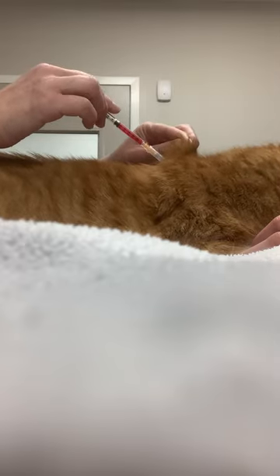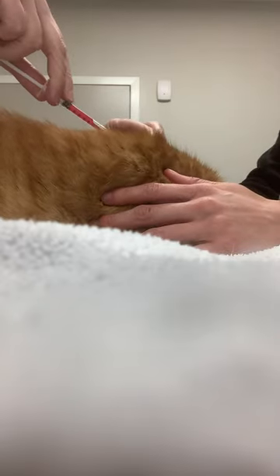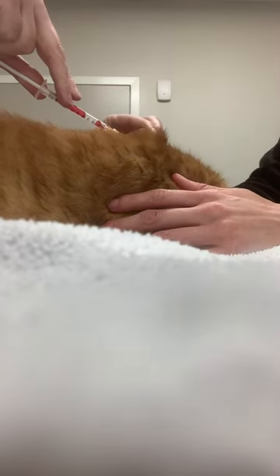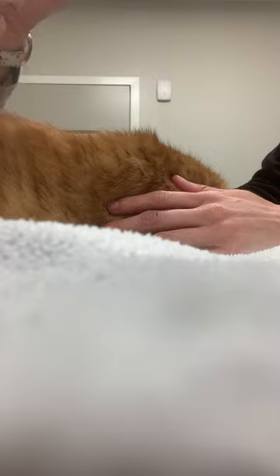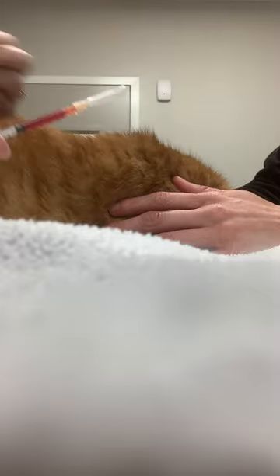Before you give the B12, you can pull back on the plunger. If you get a lot of air, that means you've gone through the skin, so you'll want to get the air out by shaking the syringe, getting it back up to the needle, and then injecting.